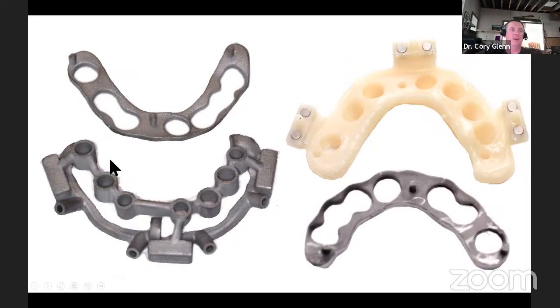Well, if you've done a reinforcement like this, then if that cylinder doesn't fall perfectly within this hole, now you're trying to adjust and stretch this hole in chrome cobalt, which you might as well just bang your head on the wall, because that stuff is so hard. You'll go through 500 burrs trying to adjust it and stretch this long vertical hole in chrome cobalt. So the solution to that, once I knew it was a problem, was to, instead of making a vertical metal reinforcement, now I just basically make the bottom side of my temp be metal with really big passive holes, right, for pickup. That way, if I have to move a hole over a little bit or something, it's really not going to affect me that much.